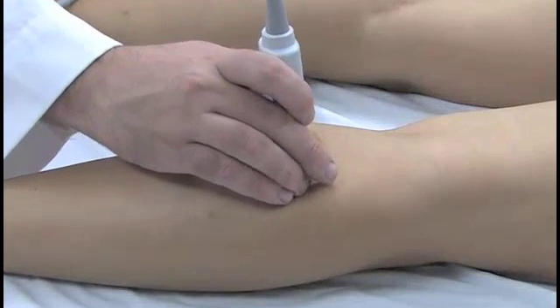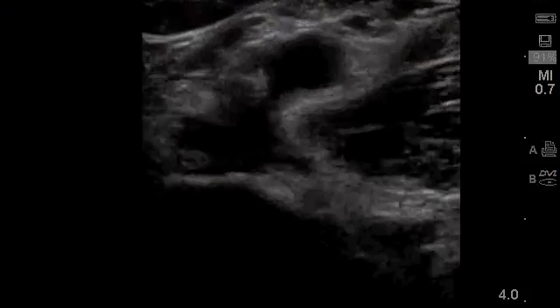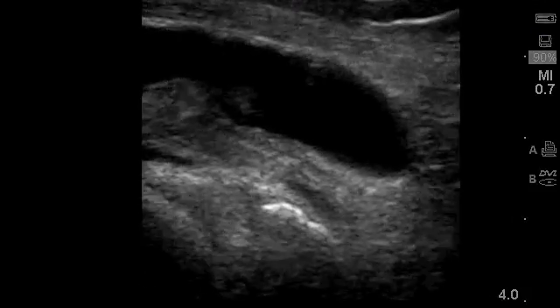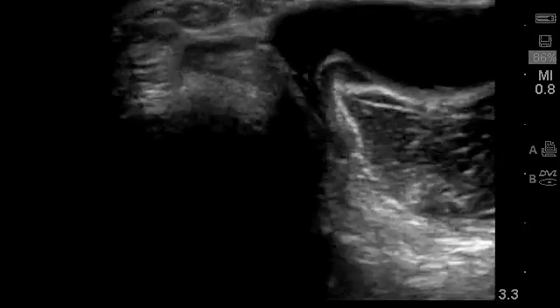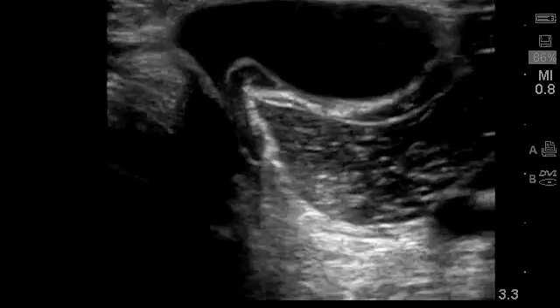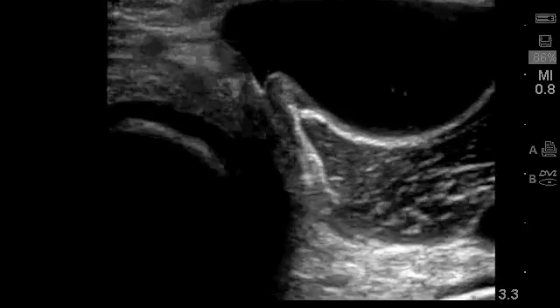You perform an ultrasound-guided evaluation of your patient's right popliteal region. You identify the characteristic three components of a Baker's cyst in the transverse plane and evaluate the inferior margin of the cyst in the sagittal plane. The ultrasound diagnosis of a Baker's cyst depends upon identification of the channel, or neck, between the semimembranosus tendon and the medial head of the gastrocnemius muscle. Do not exclude the possibility of an infected cyst based on ultrasound findings alone.